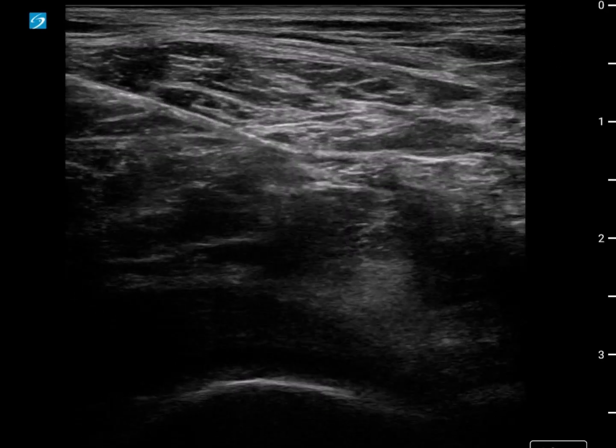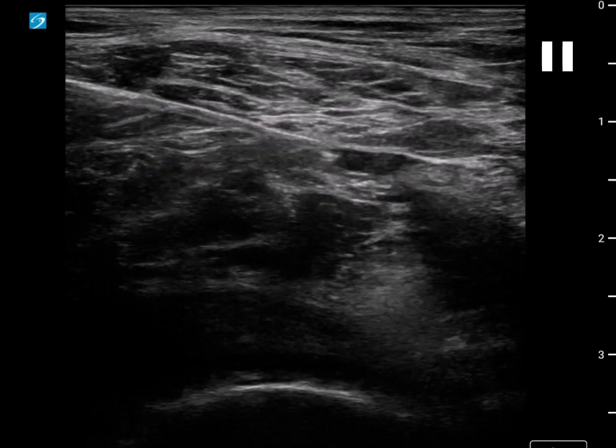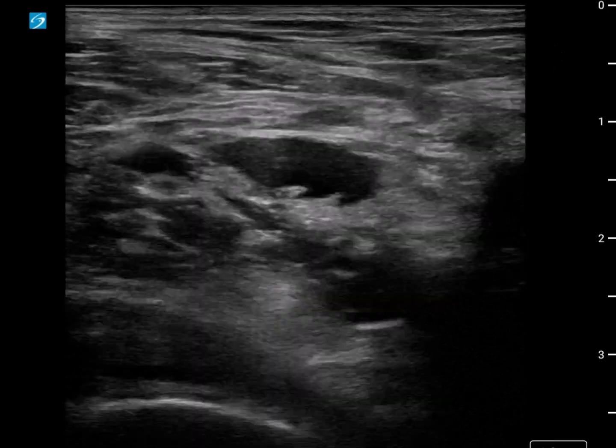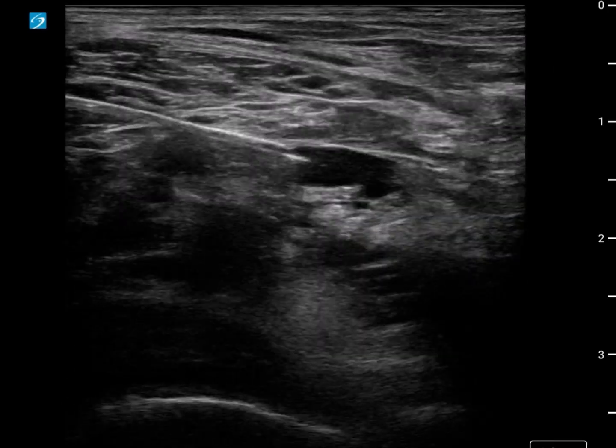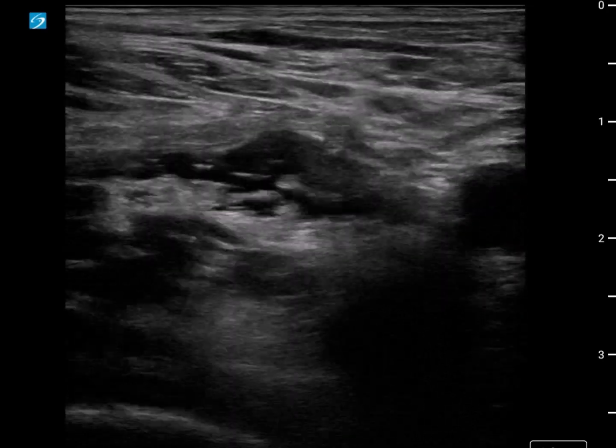We're going to pop in very gently, and we're going to start with another little hydrodissection - and that's immediately better spread. We've got beautiful local anesthetic unzippering spreading medially. By letting the local do the work, it's opening the space, and then we're advancing the needle. Always let the local do the work as we hydrodissect across.